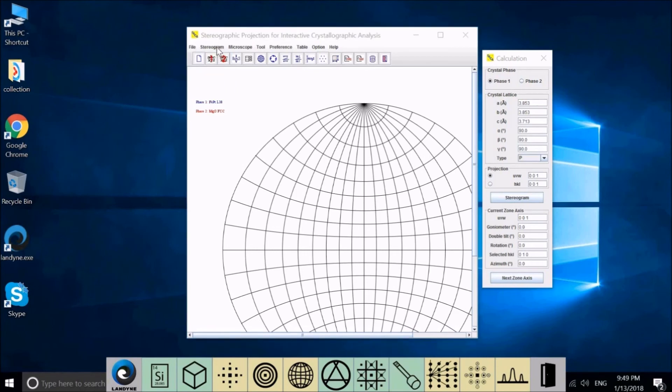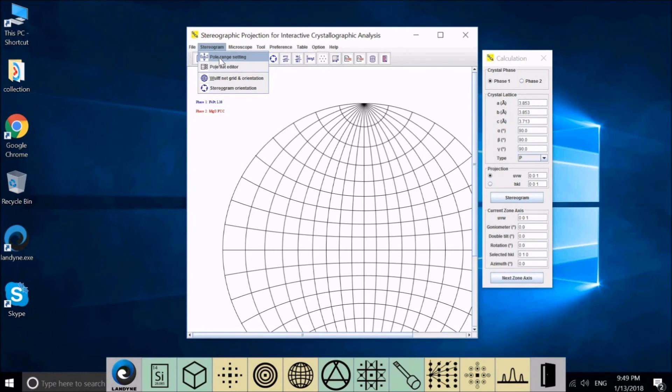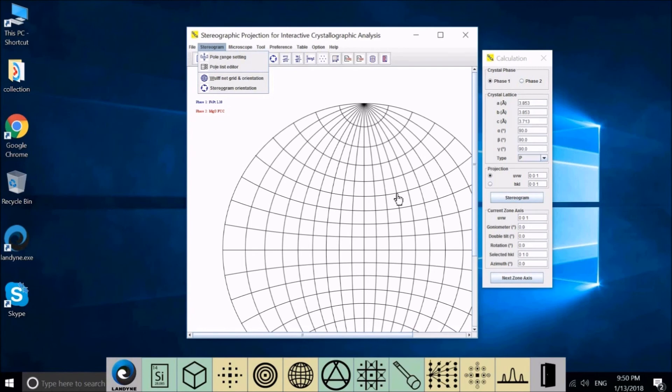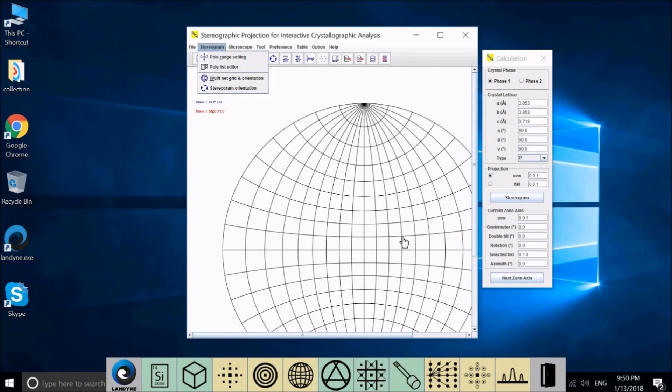In Stereogram, the first one is pole range setting. This will decide the maximum of HKL or UVW and how dense the poles on the stereogram. The pole list editor will allow you to add new poles in the stereogram or remove existing poles. Wulff net grid and orientation and stereogram orientation will allow you to change the number of the grid and set the orientation of them.